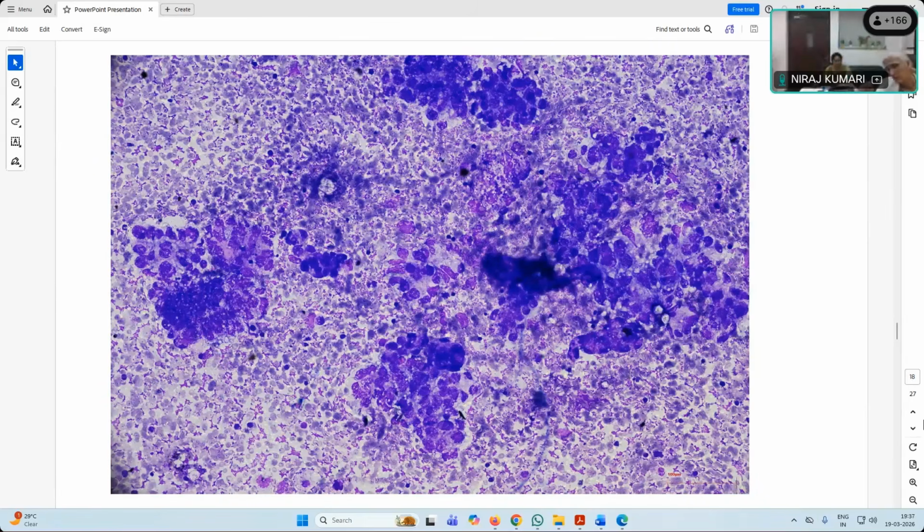Just a minute. The neuroblastoma and lymphoma will have a very monomorphic kind of cell population. You see the structures here, and they're forming cohesive clusters and tubules as well. So lymphoma would not show you this kind of structures. And then we see the chromatin. Chromatin looks bad, slightly coarse. So we have ruled out all these. Now you were talking about PNET. Can it be PNET?